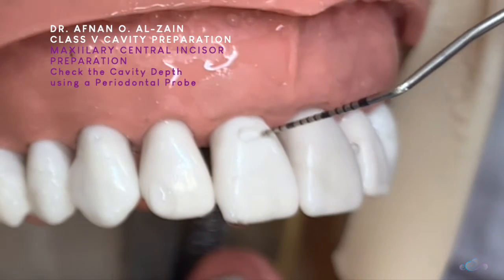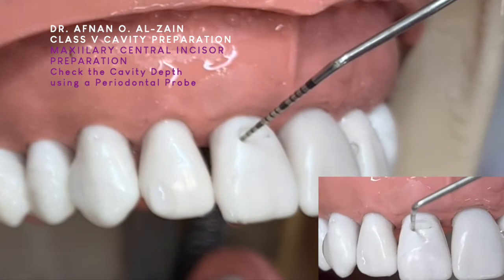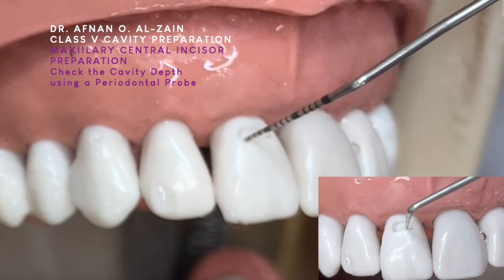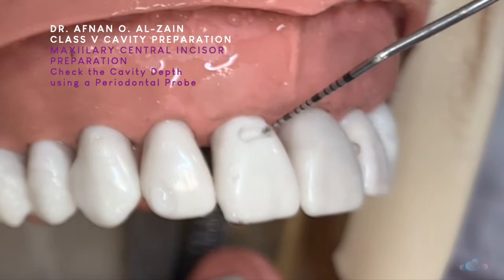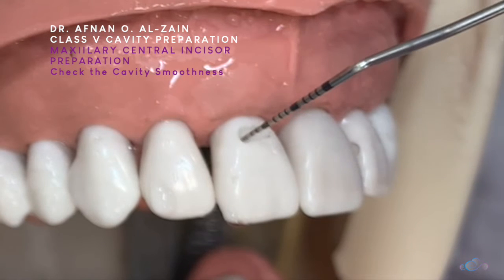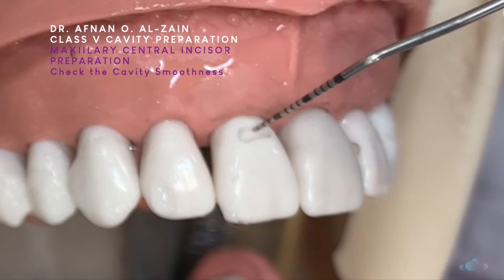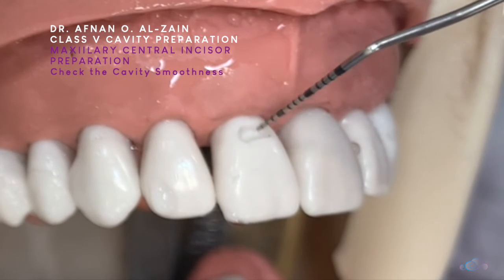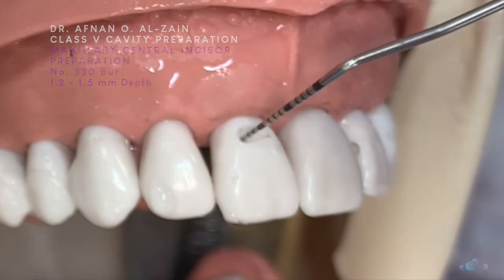We're going to check the depth — this is 1 mm depth. We're going to check the floor. We're going to increase the depth and smoothen the floor.